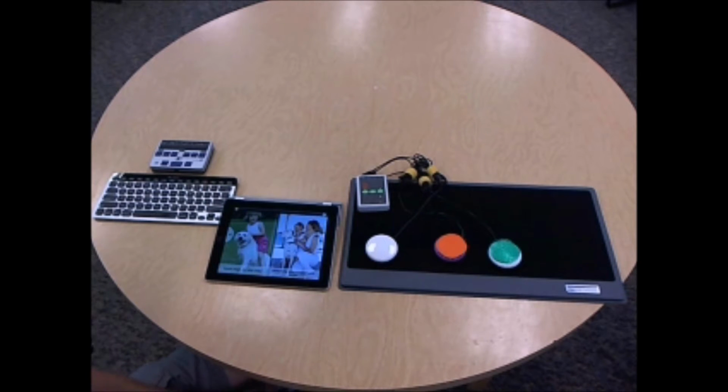The fact that it has a voiceover option therefore means that it is accessible to teachers of the visually impaired who are blind. And this device is, in my opinion, the one that should be used with that population group. I'm going to show 4 or 5 apps and just go through a switch progression, and I have more information about this on the website.